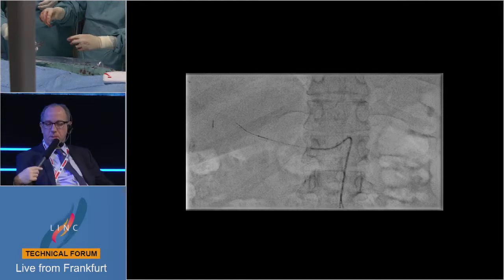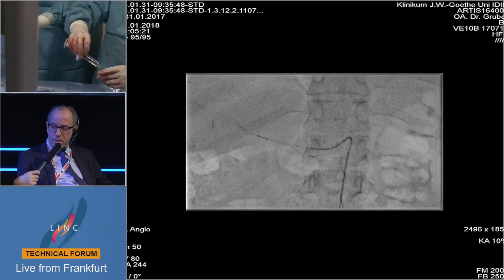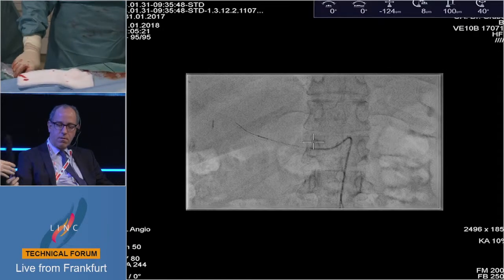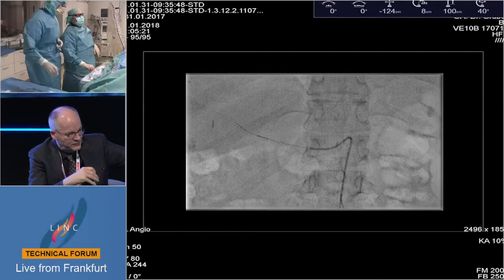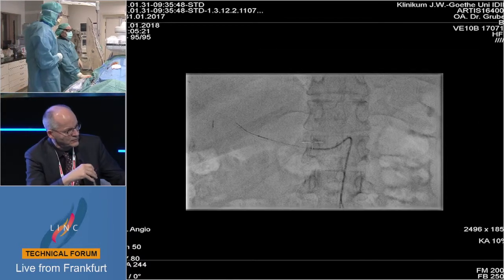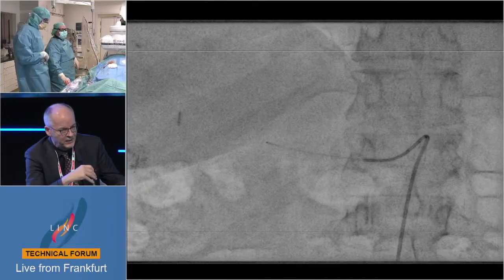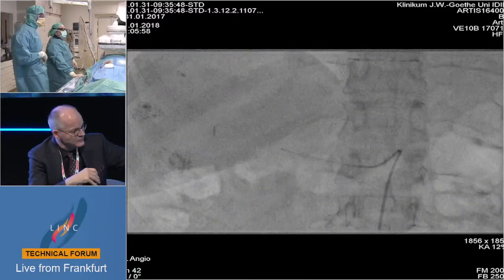Are the problems ischemia, or that the radial artery occludes and you're unable to re-access the patient? We made a questionnaire on about 25 cases we did, and we gave the patient an option for the next time, whether he wanted a radial or femoral access again. We have an occluding system also for the femoral access, and the patients were more in favor of the femoral access.